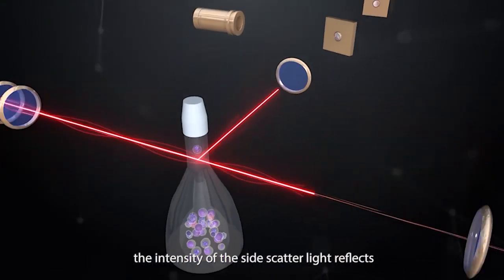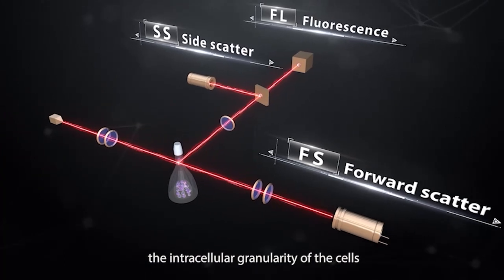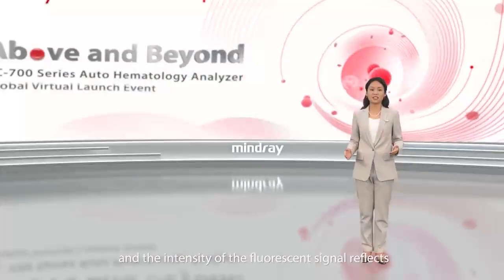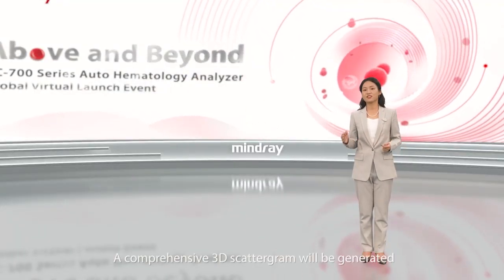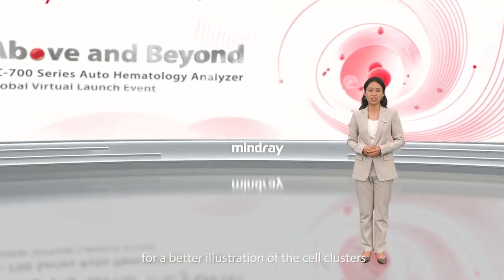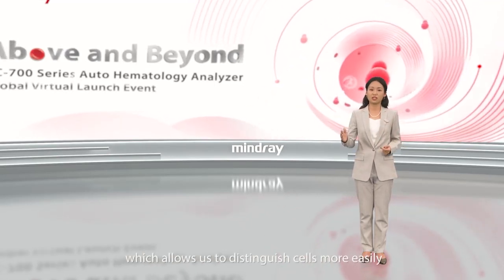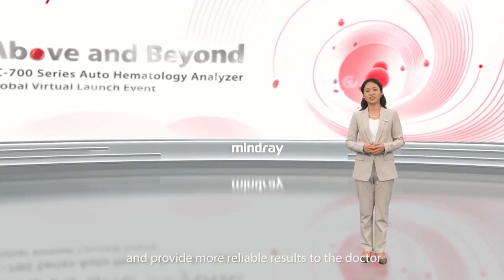The intensity of the side scatter light reflects the intracellular granularity of the cells, and the intensity of the fluorescent signal reflects the nucleic content of the cells. A comprehensive 3D scattergram will be generated for a better illustration of the cell clusters, which allows us to distinguish cells more easily and provide more reliable results to the doctor.